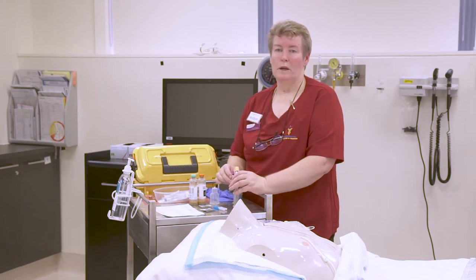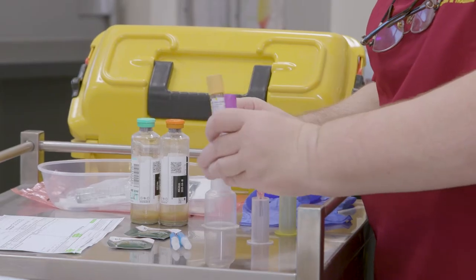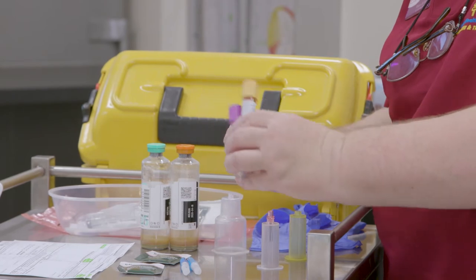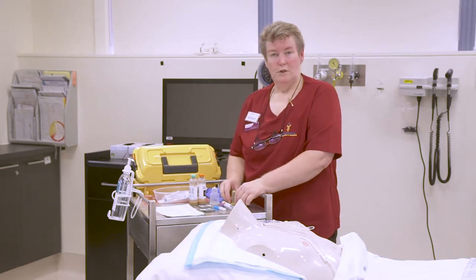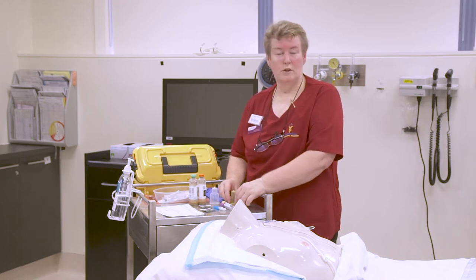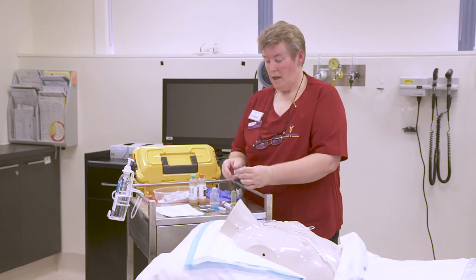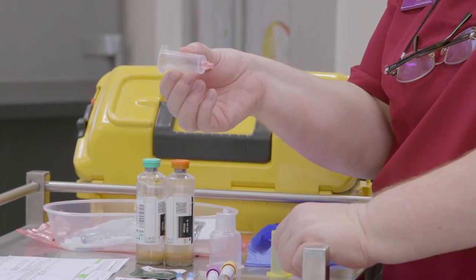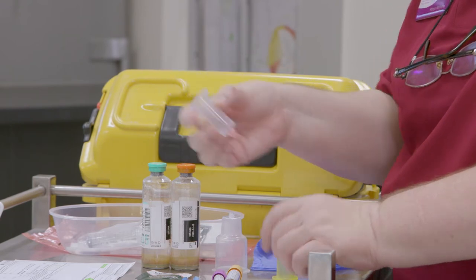Generally, patients will be ordered LFTs, UECs and FBE. So in that case, we collect from our yellow tube and then our purple tube. And then we must flush. If you prefer to use syringes, that's okay, but keep in mind to use your non-touch technique to protect your key parts and use your transfer device to ensure you minimise the chance of needle stick injury.